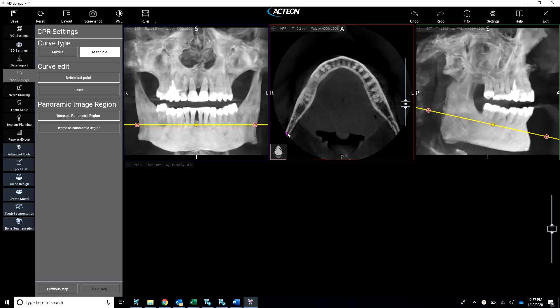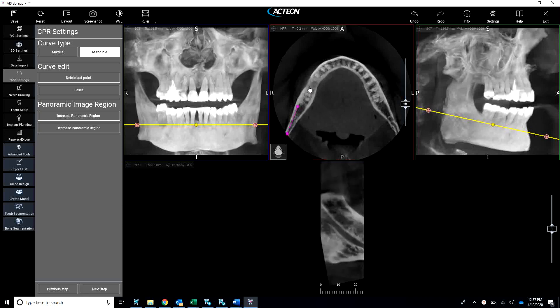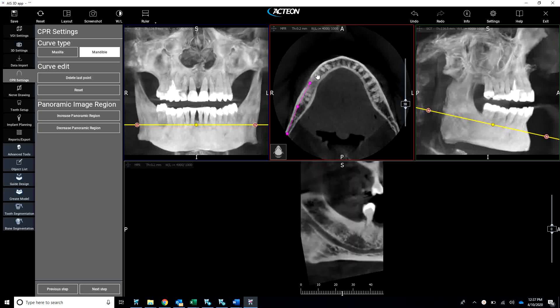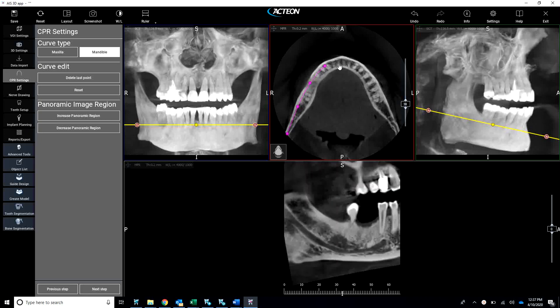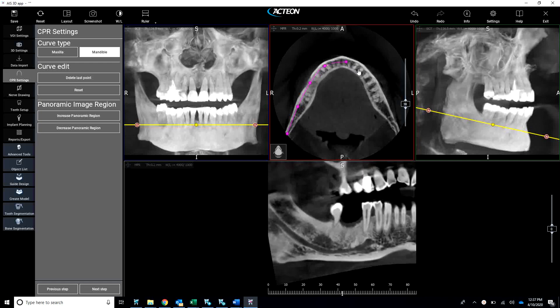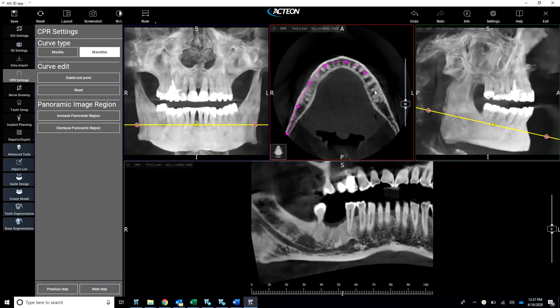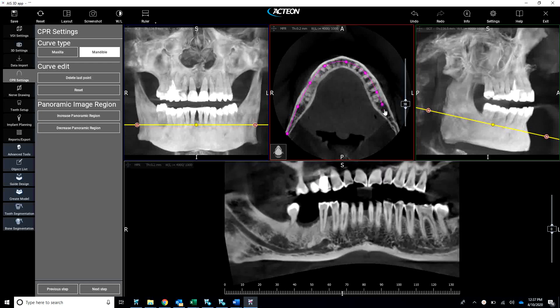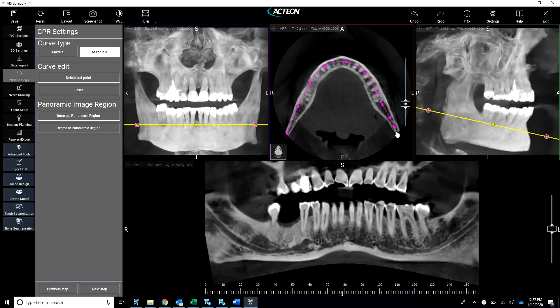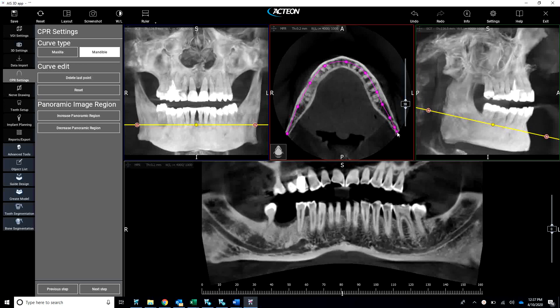We're going to start by clicking down here on the bottom of the mandible and continue that series of clicks around the arch. As you can see, it brings in that nice little custom pano view at the bottom. We got our nerve right here that's nice and pronounced. Go to next step.